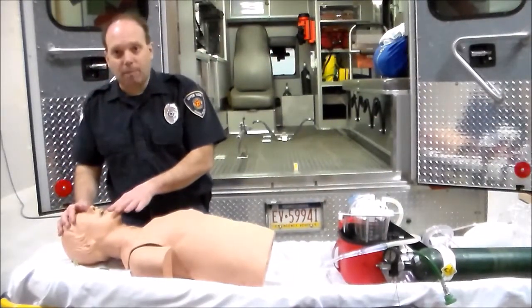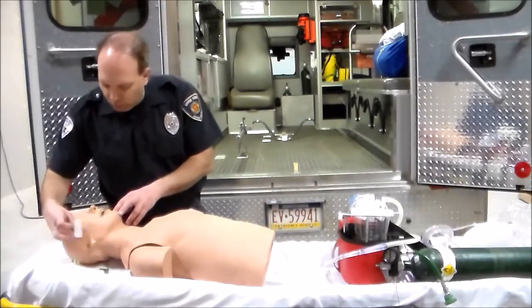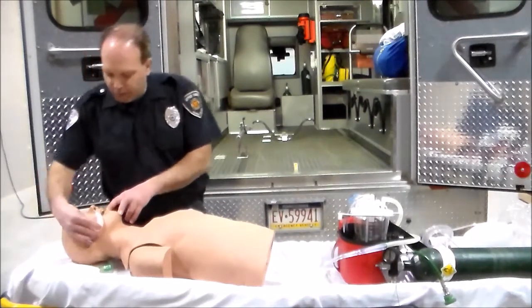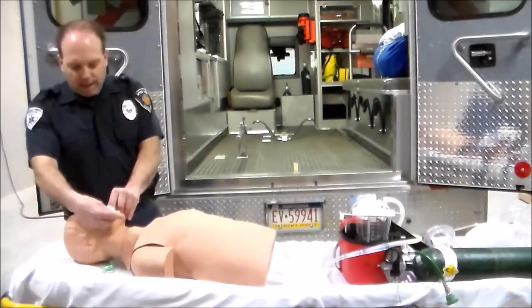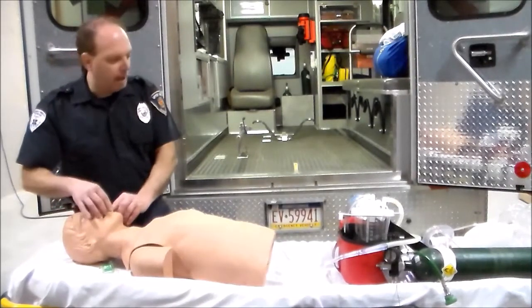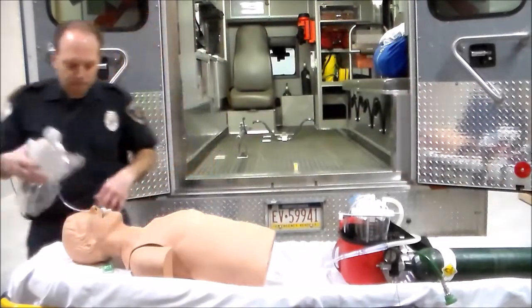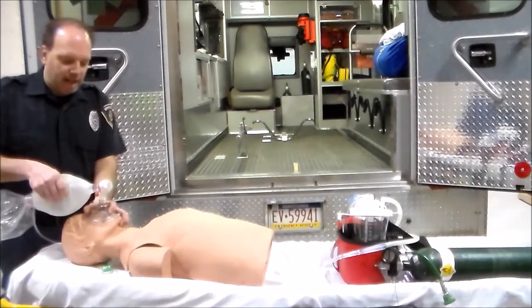At this point I'm going to measure my oral airway. That one appears a little bit too big — this one appears to be just right. We're going to go ahead and insert the oral airway.